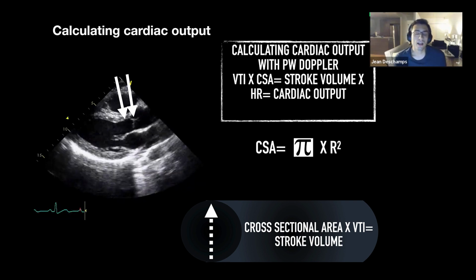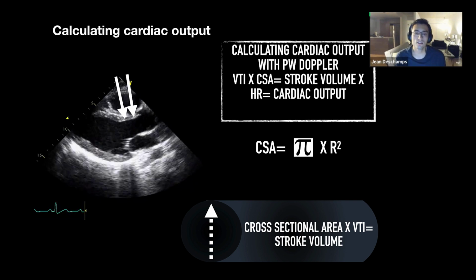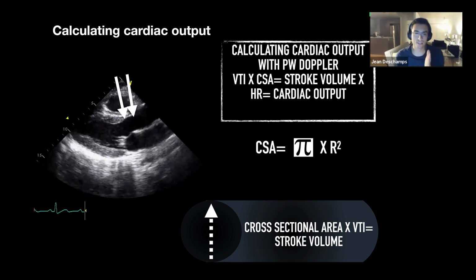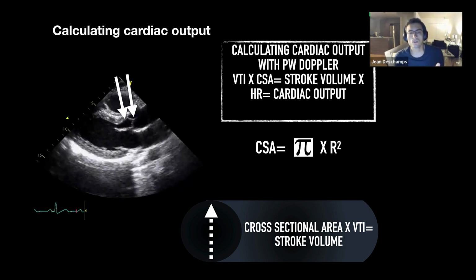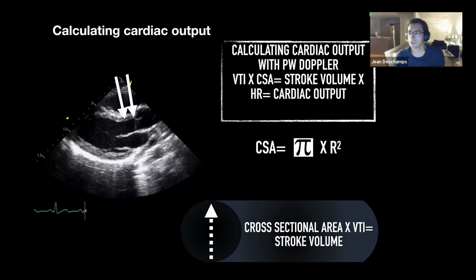No, absolutely. And I think you're right. In reality, on a day-to-day basis, I can't say I always measure it, because I'm not looking at an extremely precise cardiac output. I'm looking at, is it really high or is it really low, right? And so that measurement, we know for a number of reasons, is already inaccurate.